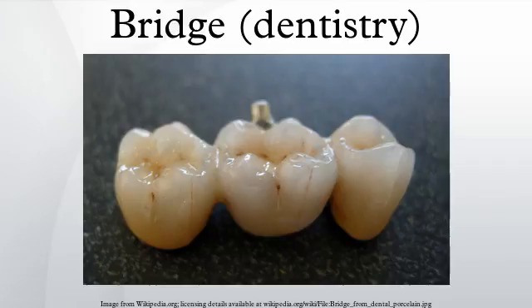This must also conform to Ante's rule but, because there are only abutments on one side, a modification to the rule must be applied, and these bridges possess double abutments in the majority of cases, and the occlusal surface area of the pontic is generally decreased by making the pontic smaller than the original tooth.